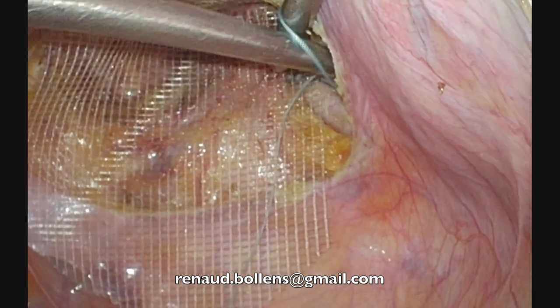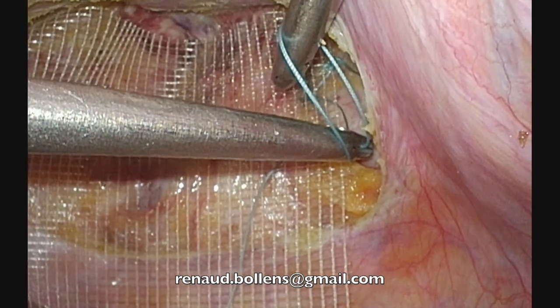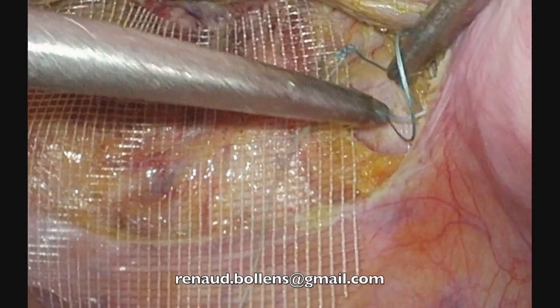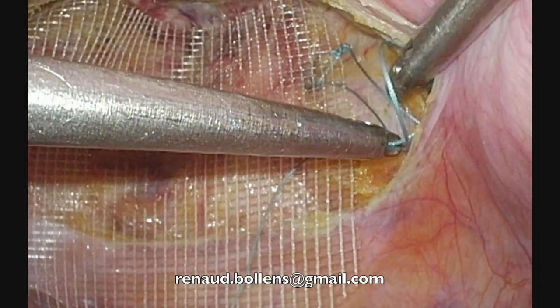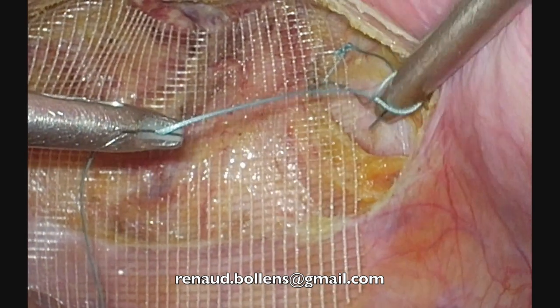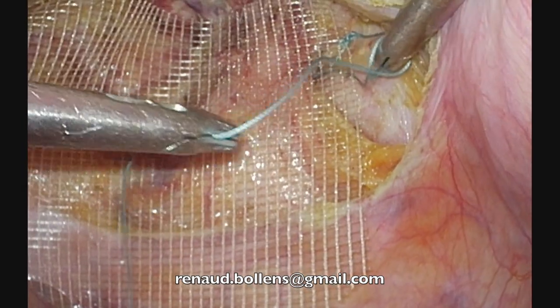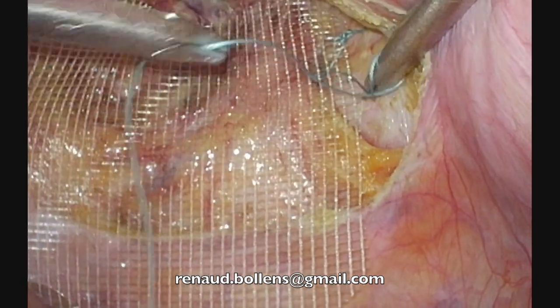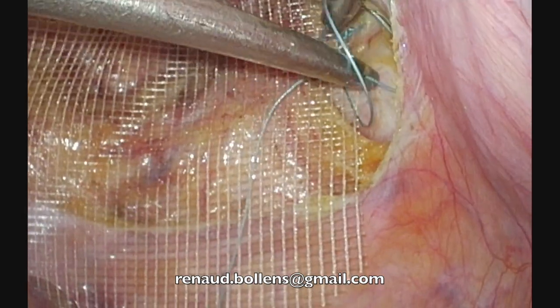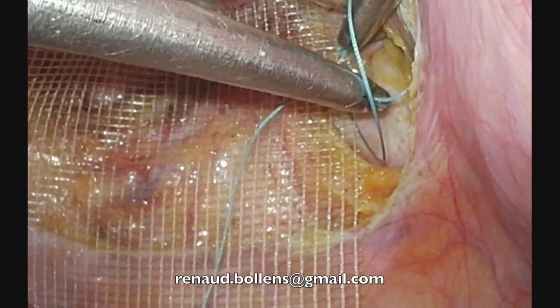It's different than if you have a half loop. This is a half loop. You see, it's like an inverted U. Half loop, full loop. If you have a full loop, the problem is you catch the short thread and you fight to remove the short thread from the loop, and you cannot do it without tension on the fixed point. Okay. If you have a half loop, it's much easier to come outside the loop.